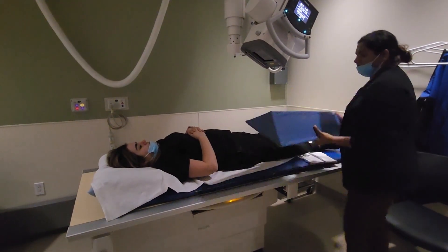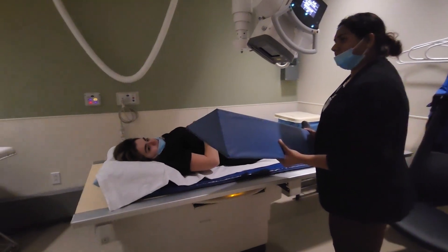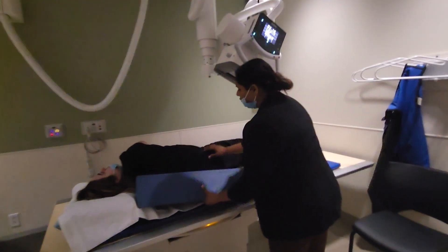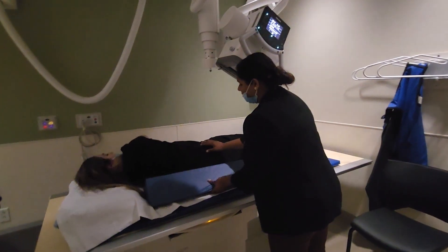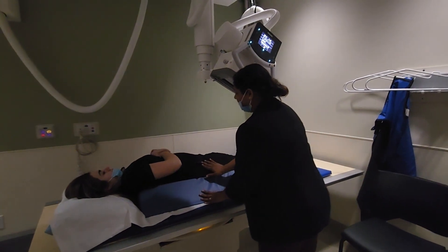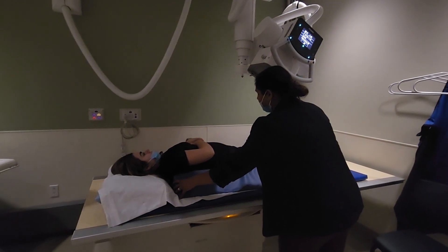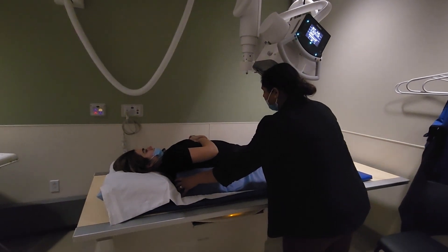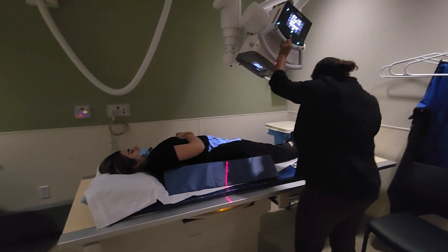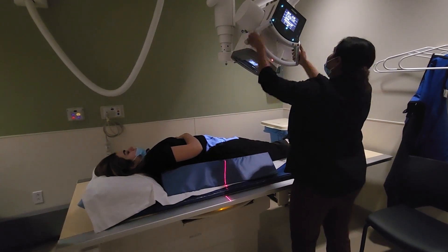You can still use the wedge, but not like where you would normally use it. So turn a little bit, not too much. Make sure the patient is not at 45 degrees — come back just a little bit more. Do we have a tube angle on this? No, we do not.